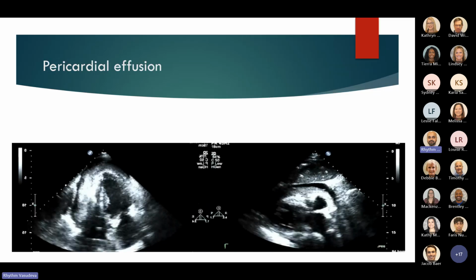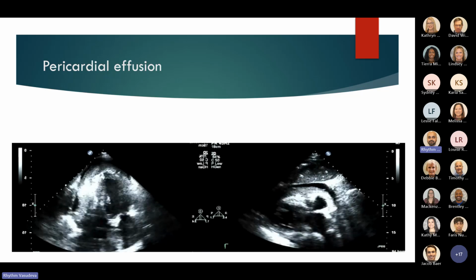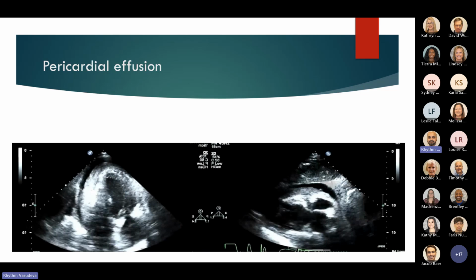So here's a patient with an MI who we did a bedside echo on and noticed pericardial effusion. Anyone with thoughts?